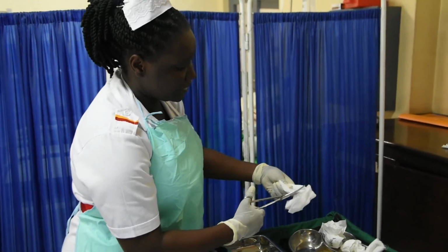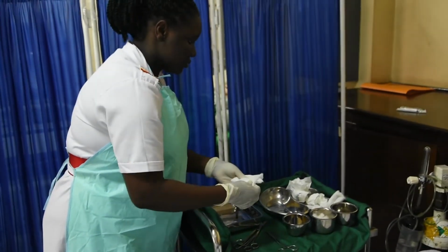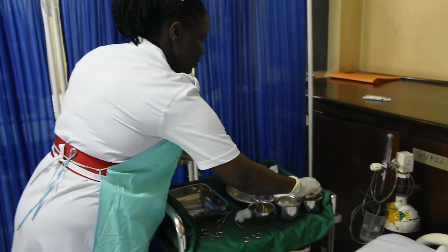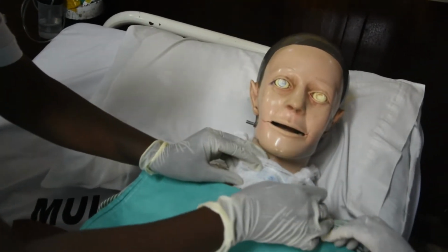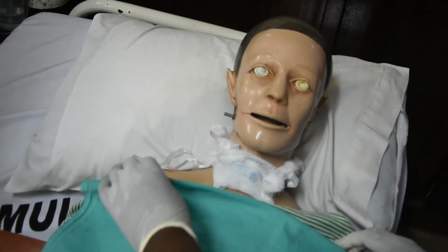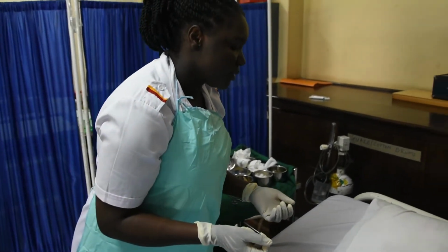This will be to moisten our oxygen which will be entering the patient. So it has to cover the tracheostomy tube. This will help to trap some dust which might be entering the tube, or even to humidify the oxygen which has to enter the tube.